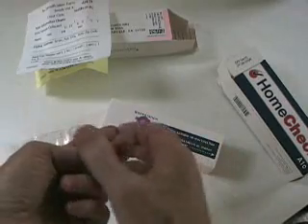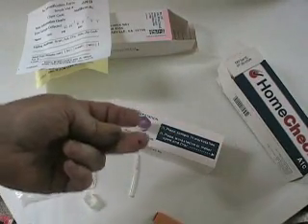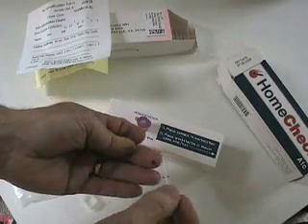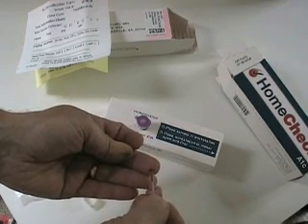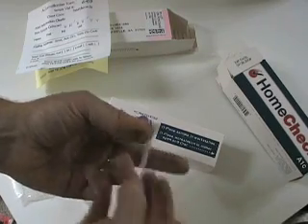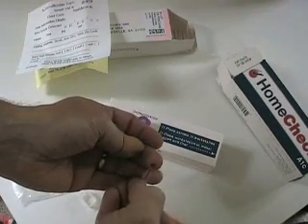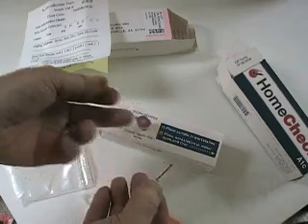A little bit of a sting, but really not too bad. I'm going to squeeze it — here's a nice sample of blood. I'm going to put this end here against the blood sample, trying not to squeeze it. I need a bit more blood. You do need a very substantial drop of blood for this to work properly. There we go — now it's filled up.